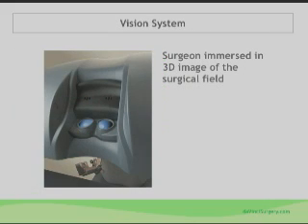The other thing that I didn't mention is the visualization, okay? The Da Vinci system is like, you remember the 3D viewfinders? Everybody get that picture in your mind. You could see Bert and Ernie on television, two-dimensional. Then for Christmas you got a viewfinder with a bunch of Bert and Ernie little discs. You slap it in there and you're like, man, it's like you can reach out and touch them. That's the difference between traditional laparoscopy and the Da Vinci system.